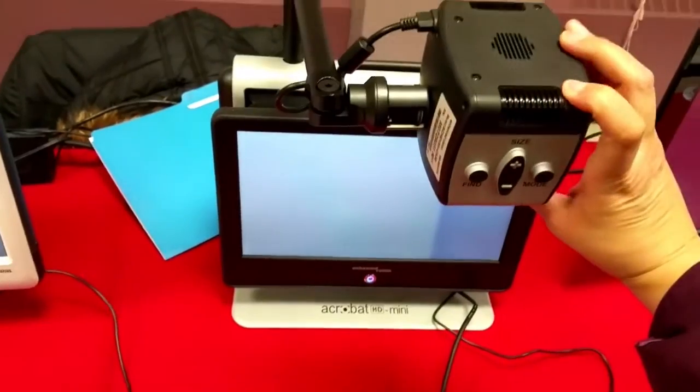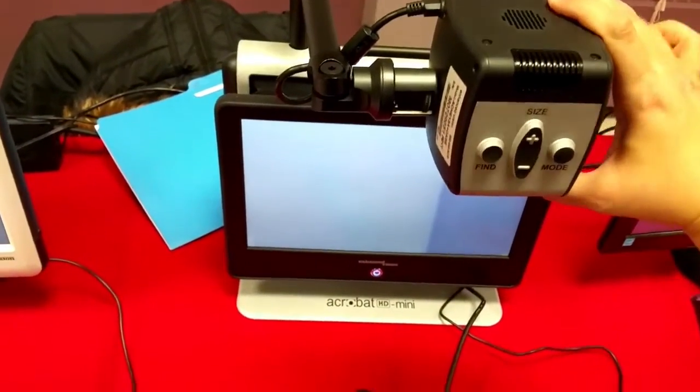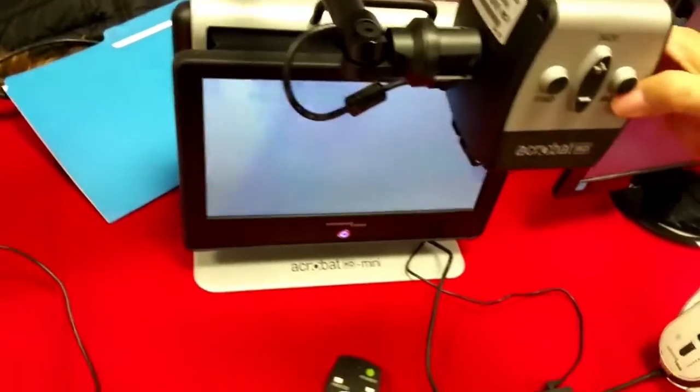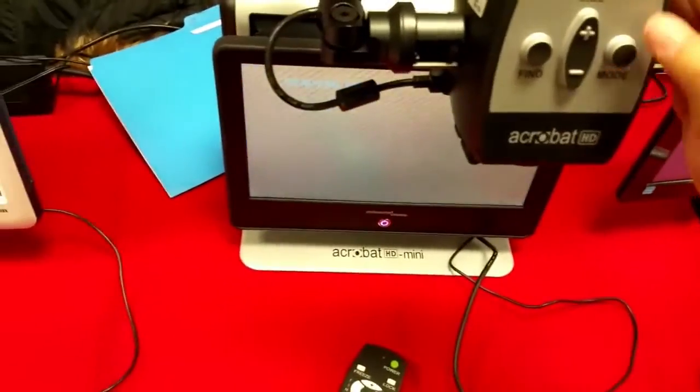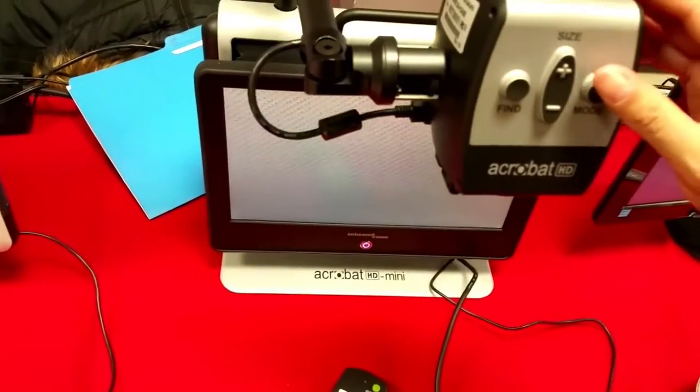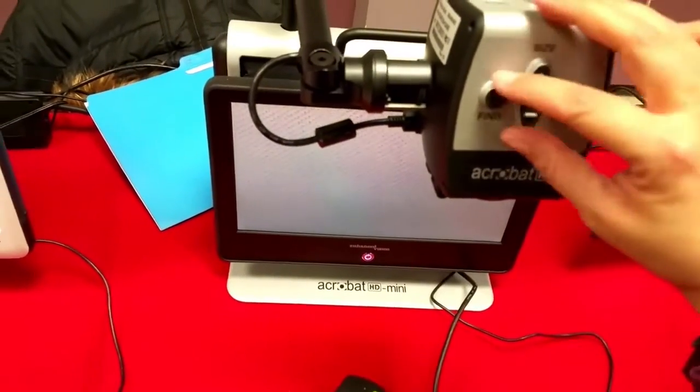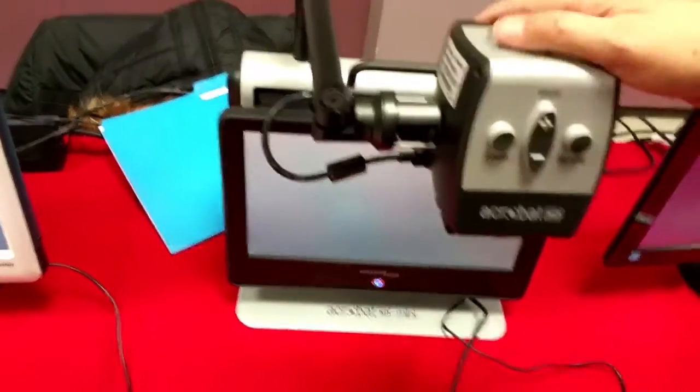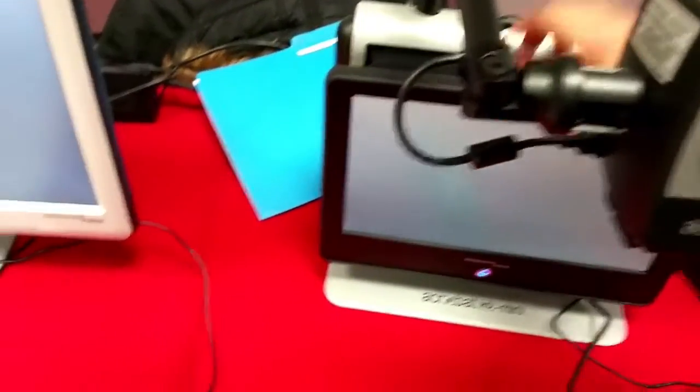Now there's just a blank beige-white wall in front of us right now so not much to see. But it's very cool, it's got a number of magnification settings. And this one, is this the portable one?